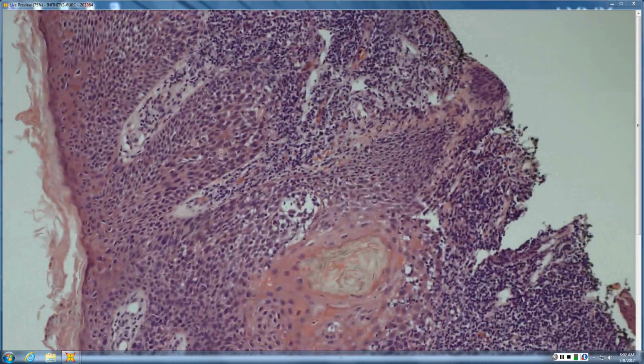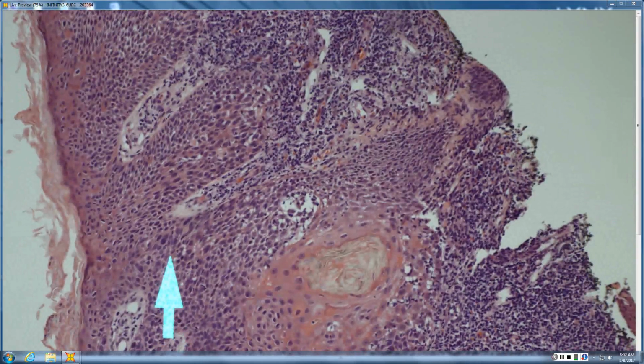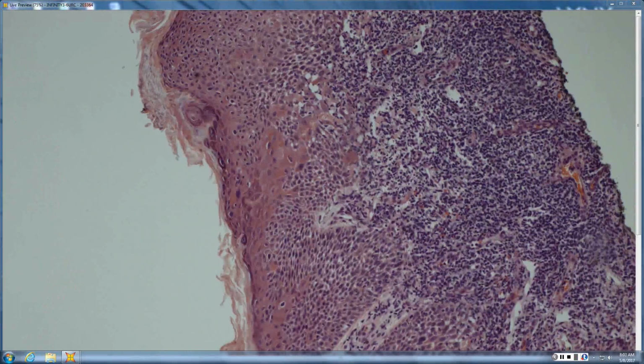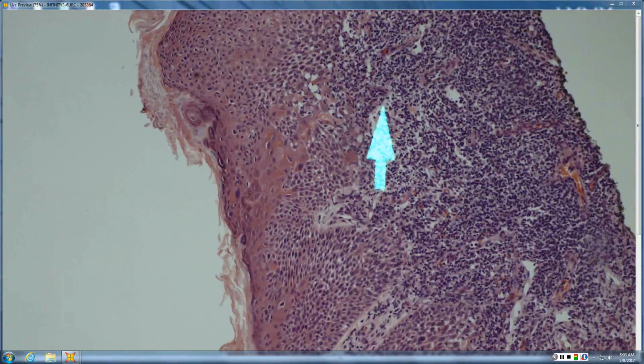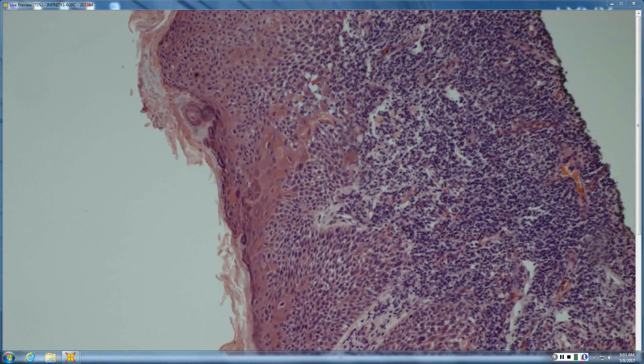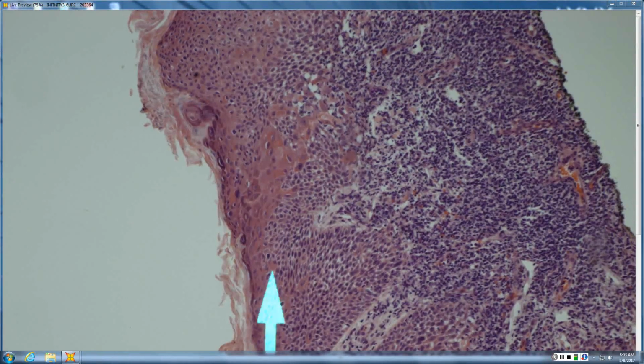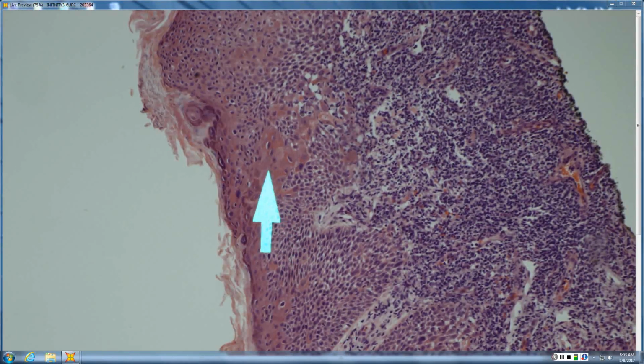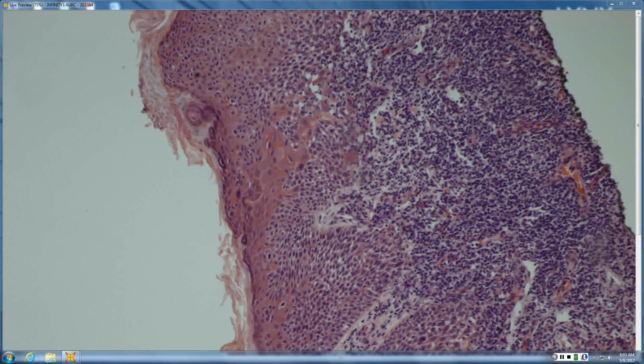When you look at the epidermis, tell me about these nuclei. They're very atypical. Very big and ugly. Too atypical to be just reactive. Agree. So this is likely the reactive part. That's just too atypical to be reactive. And then, is all the epidermis atypical, or is it clones of atypical cells embedded in what's left of the epidermis? Yeah, like kind of a clonal Bowen's type of look. Yeah, exactly. Clonal Bowen's with lichenoid inflammation, dense infiltrate.